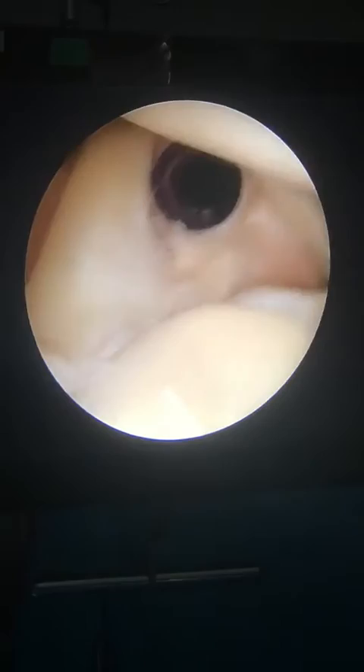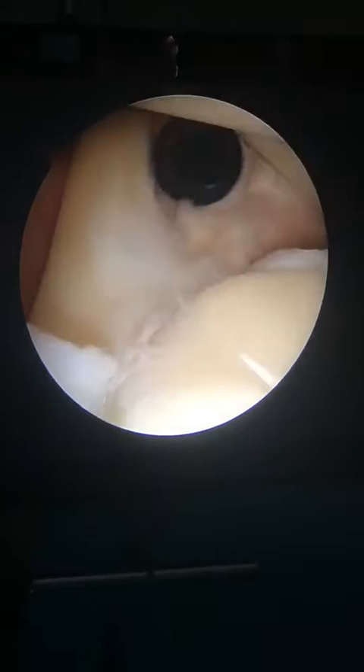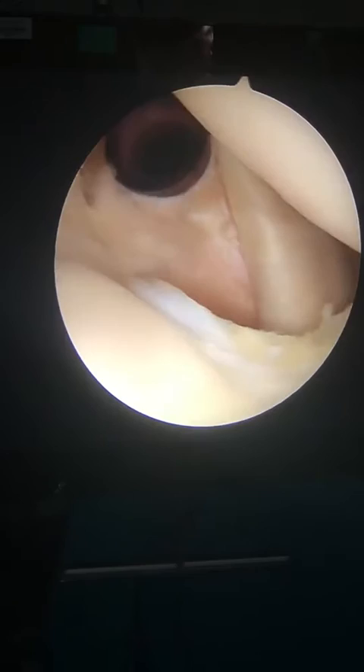This is the rotator cuff interval here where I have my cannula. And on top is the patient's bicep tendon. That bicep tendon comes from the arm and it inserts here on the superior labrum. This patient does have some fraying and some tearing of that superior labrum.